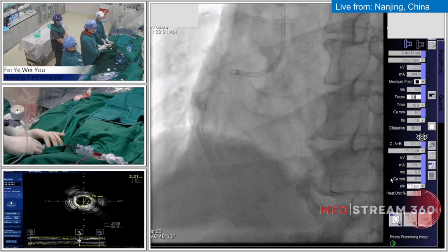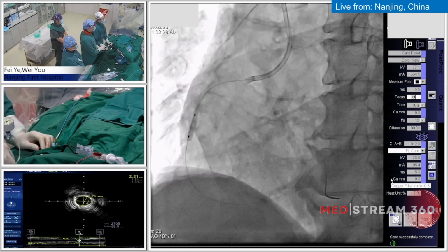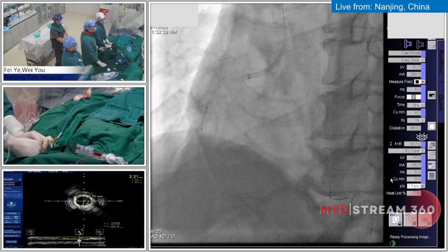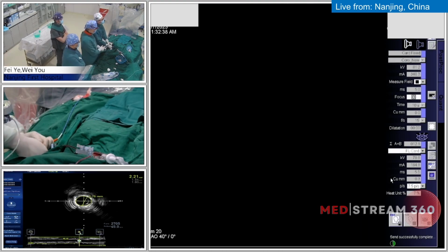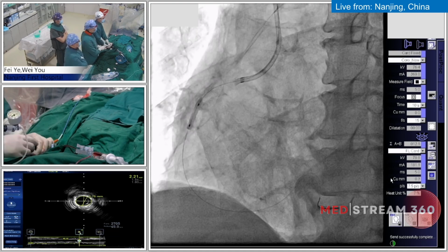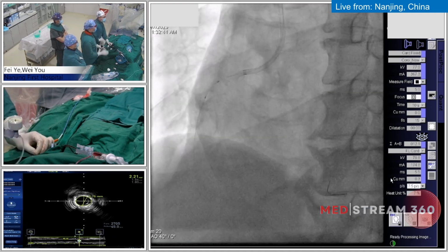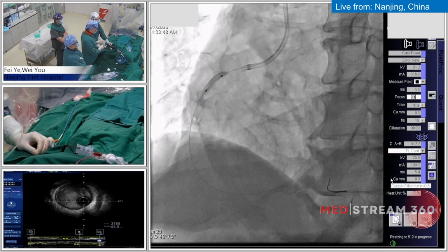Go. 12, 16, 15. Okay, done. Go again. 12, 16, 15. Okay, seems okay. Done. Okay, once more. 12, 16, 16. Okay, done.